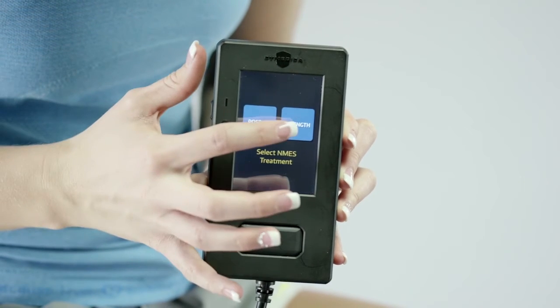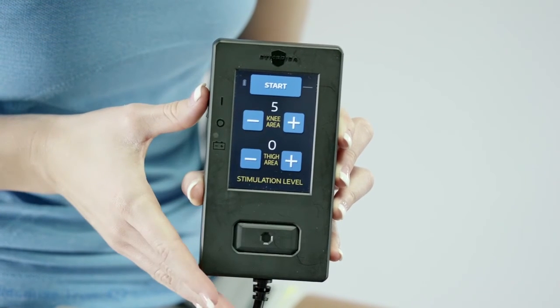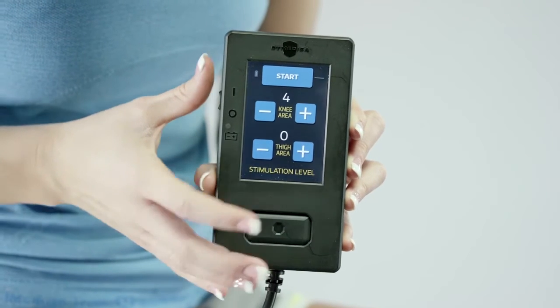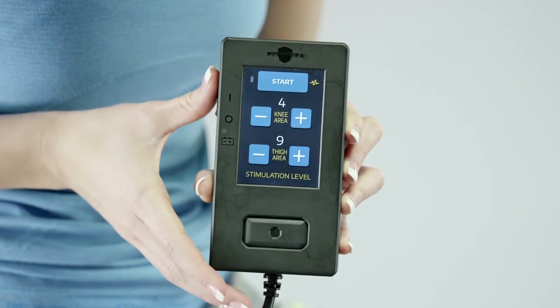Select the treatment prescribed by your medical professional. On the stimulation level screen, you set the intensity of the stimulation levels for the knee and thigh areas. Each level begins with a setting of 0 and has a maximum setting of 100. In the knee area of the screen, press plus to increase knee treatment intensity until a strong but comfortable muscle contraction is achieved. When you hit the plus sign, electrical energy will be delivered to the quadriceps muscle, which some have described as feeling like a vibration or low-level buzz. Press minus to decrease knee treatment intensity as desired. Repeat this process for the thigh area until a strong but comfortable muscle contraction is achieved. The stimulation will oscillate between the knee and thigh areas. Note that it is common to have different intensity levels for the knee area and thigh area.